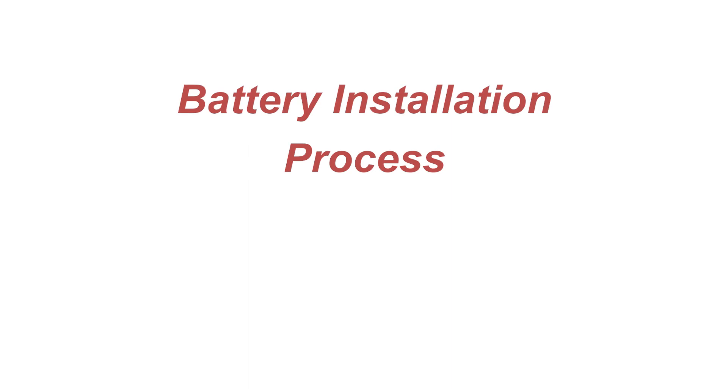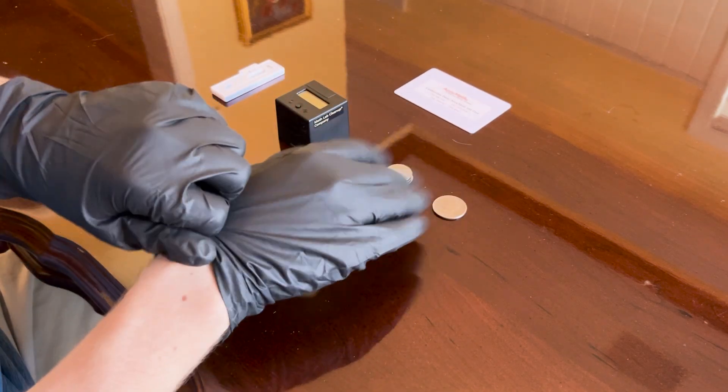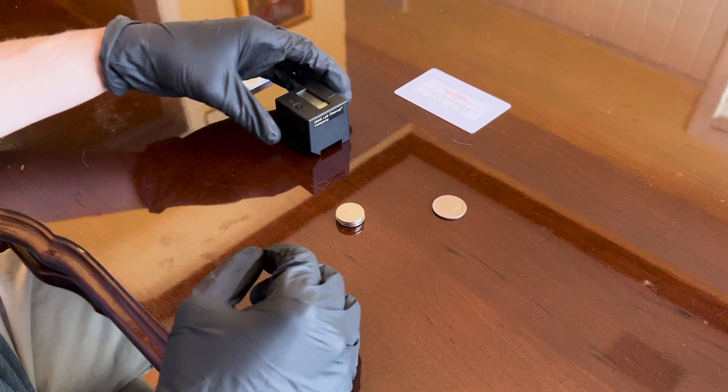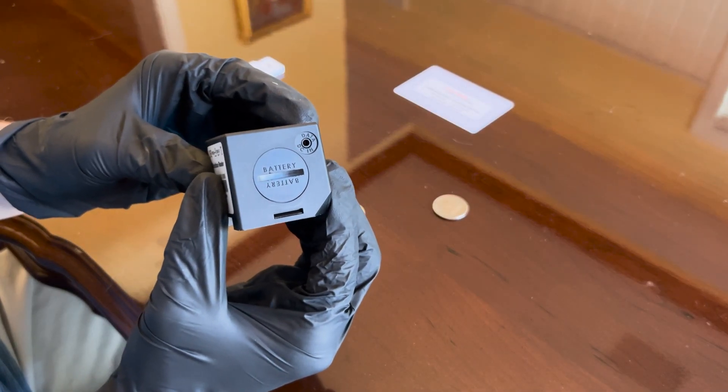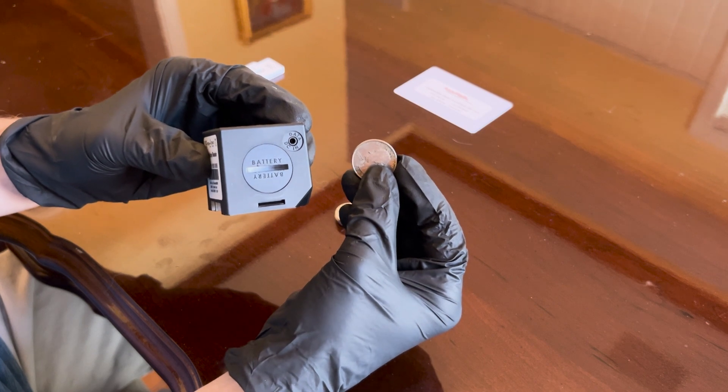Before we go over how to use the device to read the AccuMeth test cassette, let's go ahead and install the batteries and set the date and time in the device. The black box reader device is powered by three lithium batteries. It's recommended that you use gloved hands to insert them. Use a smooth edge tool such as a coin — here I have a quarter.